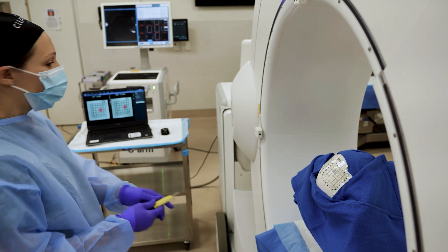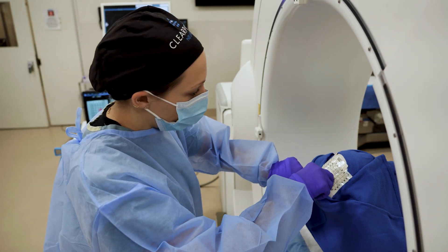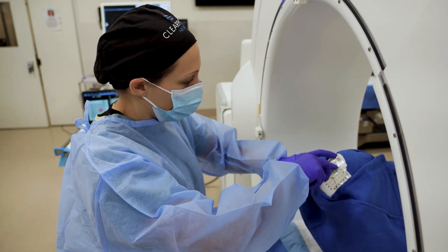After the entry points are localized, the scalp is incised and burr holes are created centered on the previously marked point.